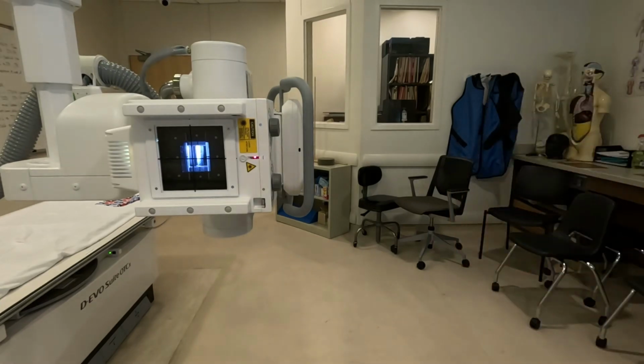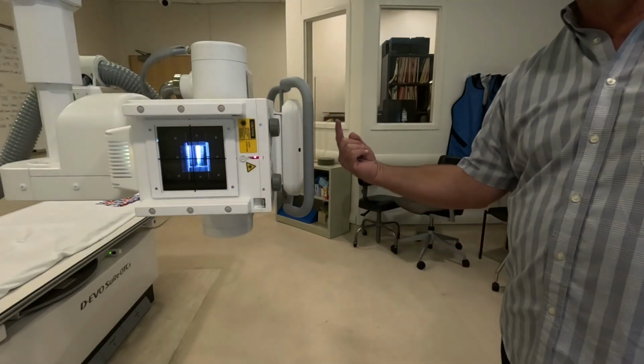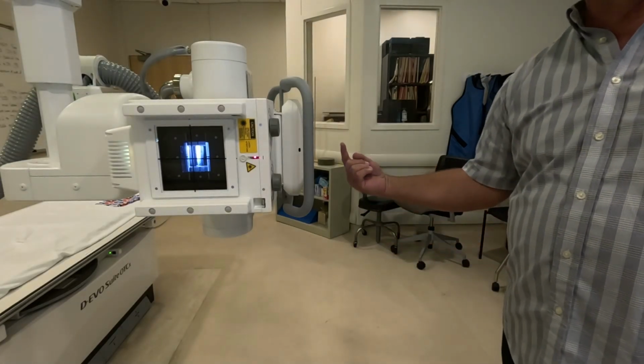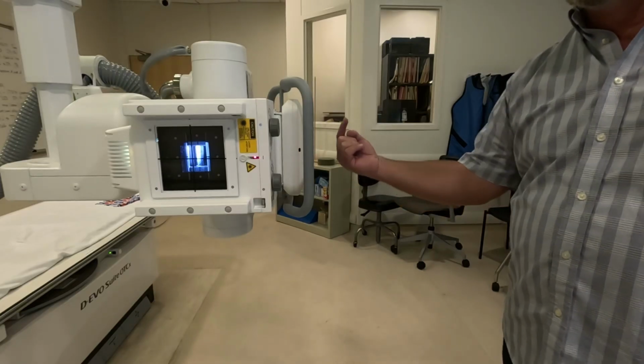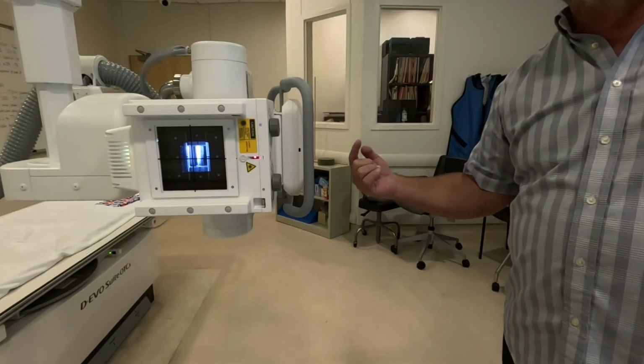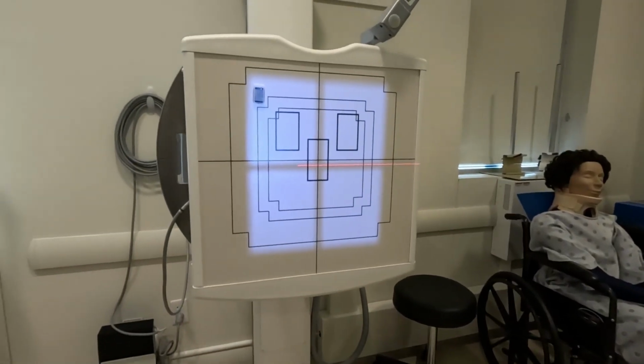So when your text says lock in the tube for chest x-ray, they're talking about two things. One is you have to have it locked in up top, right? You got to be at 72 inches if you're shooting chest x-ray, but you also have to have it locked in transversely so that you're centered to the middle of the bucky.